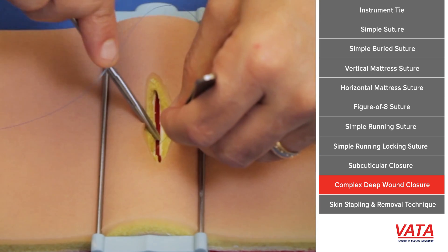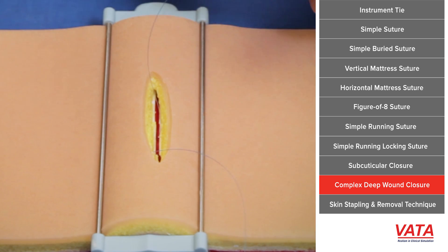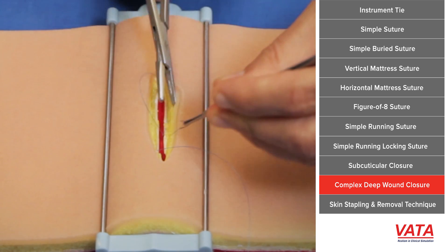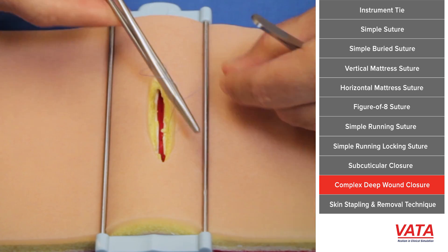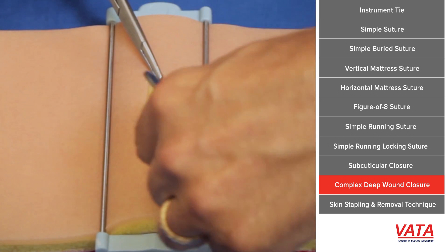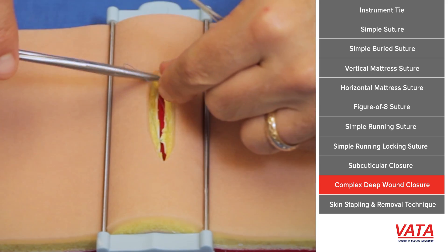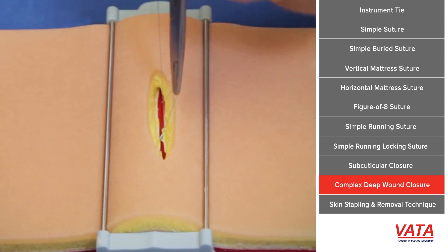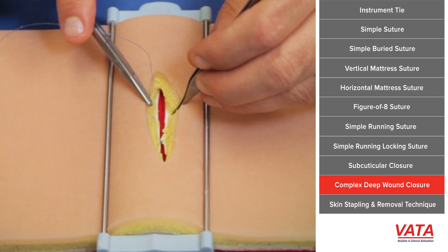What we'll do here is first close the fascia. Because fascia is generally so deep to the skin, I usually don't bury the knot — you certainly could, but you don't have to. So for simplicity, I just do a simple suture here. In some situations we might use a permanent suture; you can certainly use absorbable as well — it's kind of surgeon's choice. Remember you're pretty deep here, so you're going to want to not only lock the knot, but then once you're pulling things down it's almost easier to pull it along the wound itself, otherwise the skin may prevent you from tying all the way down.